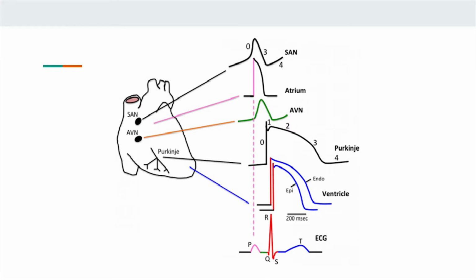You can see how they all add up to create what we see as a heartbeat on the EKG. Remember that the activity of the heart's conduction system is far too small to be picked up by the EKG machine, so the electrical activity of the SA node doesn't contribute anything in formation of the heartbeat on the EKG. The activity of the AV node just shows up as a pause, and conduction down the Purkinje fibers also doesn't contribute anything to the overall EKG.